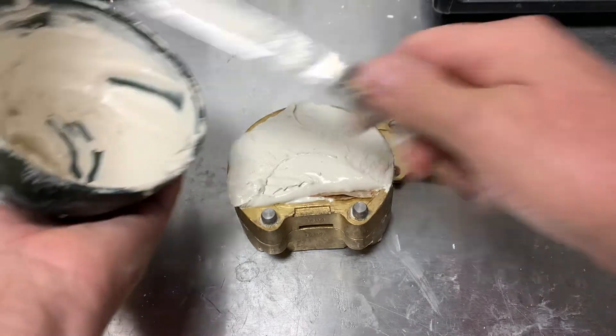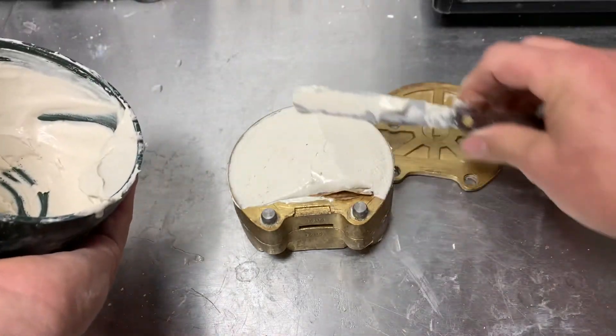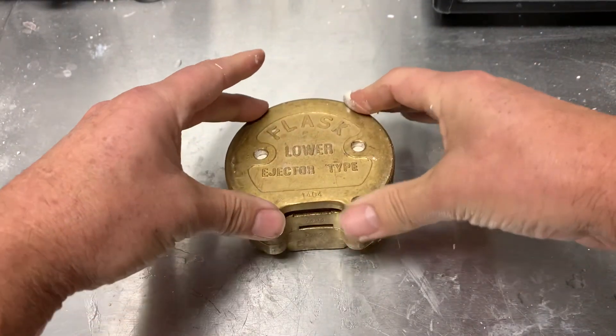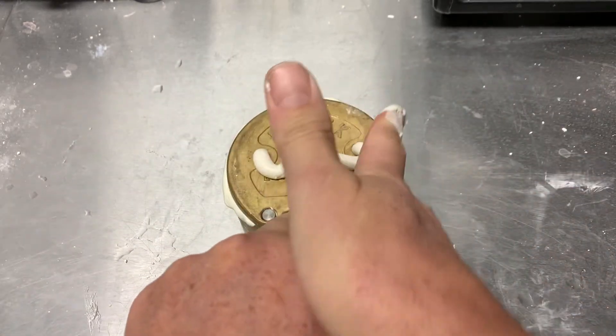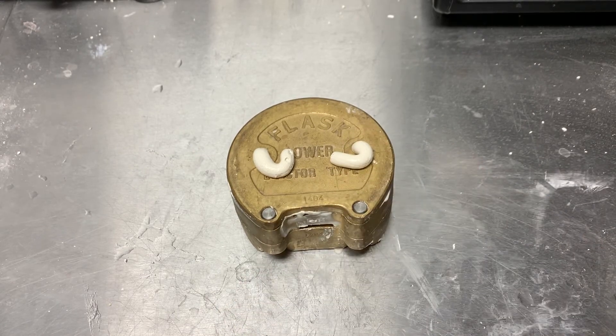Slightly overfill, then put the top on gently with even pressure all the way around and remove any excess. Then just wait for that to set, boil out the wax to soften it, treat the model with some denture separator, and then pack the case.